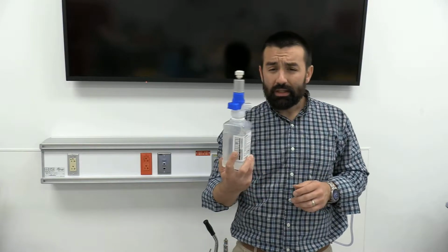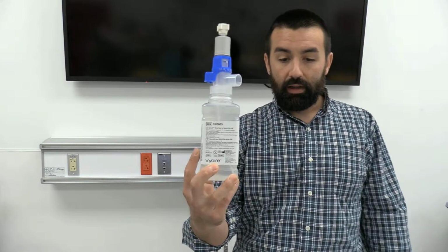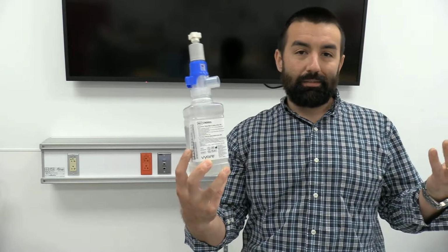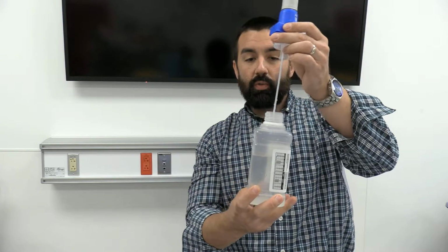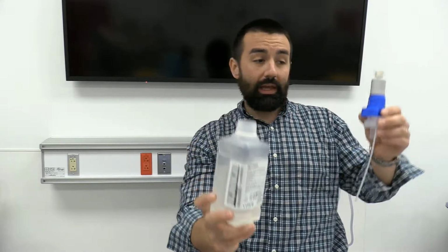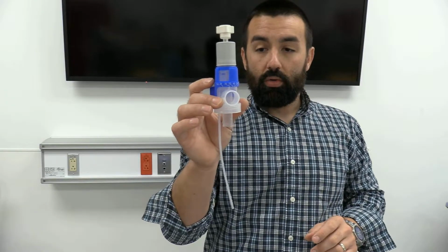So these come in a couple of different designs. Ultimately, we have sterile water for inhalation. I have a tiny bottle, so this is a 500 milliliter. Usually we'll have at least a 1 liter bottle. Supply chain stuff, I had to take what I can get. These bottles, we're not just filling up from the tap or anything. We'll usually have an abundance of replacement bottles just with a lid. Now, ultimately, we have this piece that drops down inside of that water bottle.